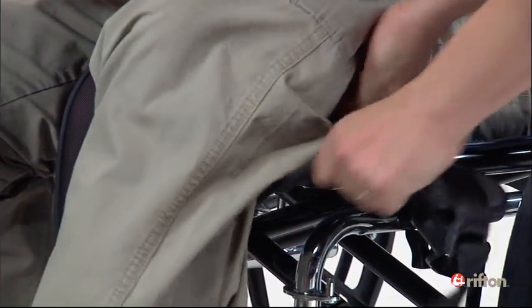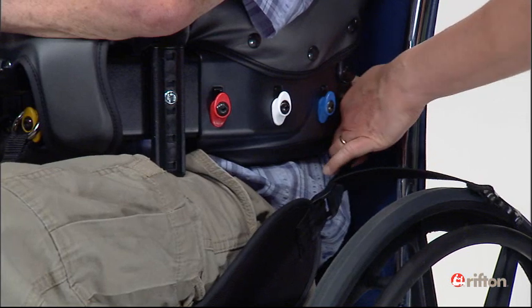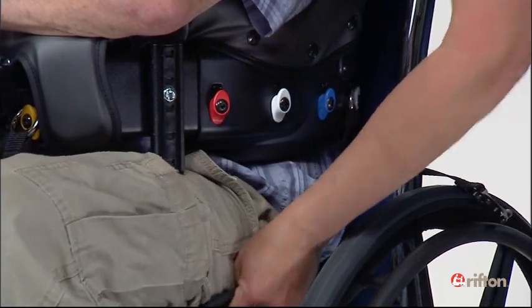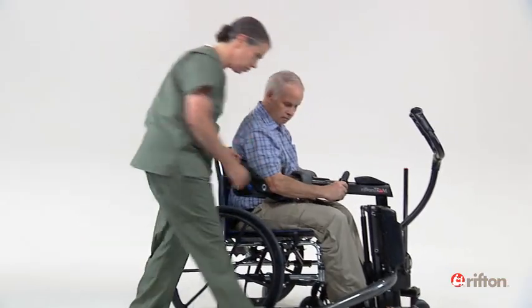Lifting your client's leg gently, bring the strap under the thigh and back to one of the side clips. The farther back you clip the strap, the more support you give your client during the transfer. Take a moment to gently work the strap back under the thigh as far as possible. Repeat the step with the other leg.